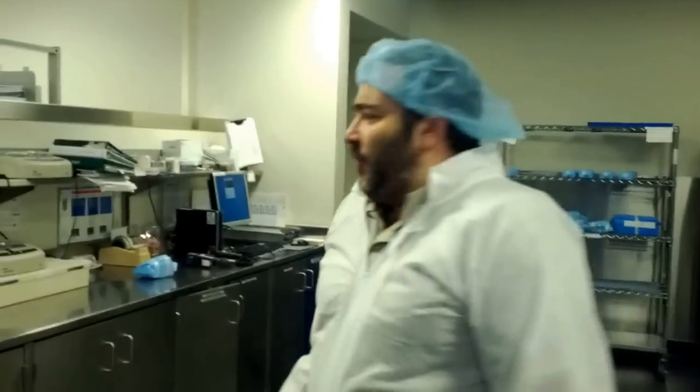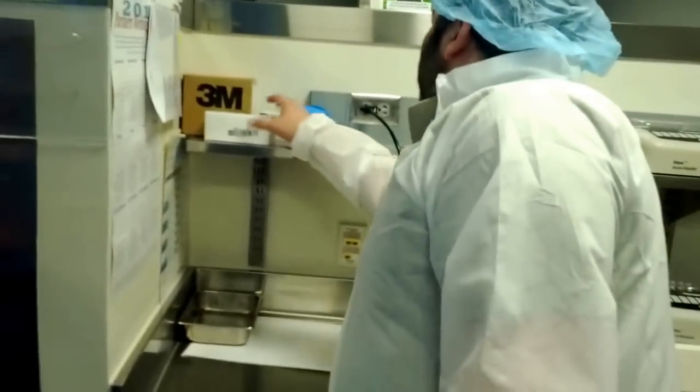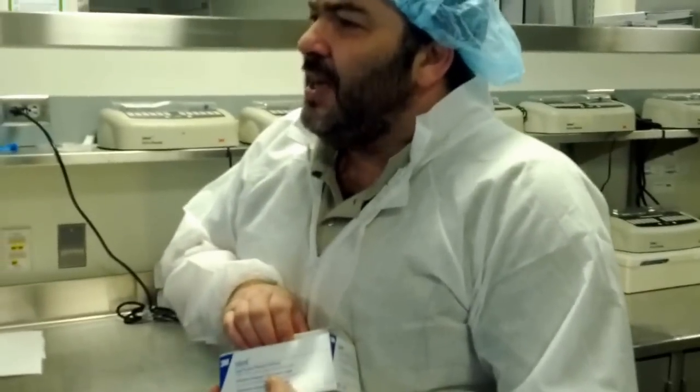Let's deal with the biologicals first. This is the area where we incubate biological indicators. Biological indicators for steam sterilization, and basically for all other methods of sterilization, is something called Geobacillus stearothermophilus.